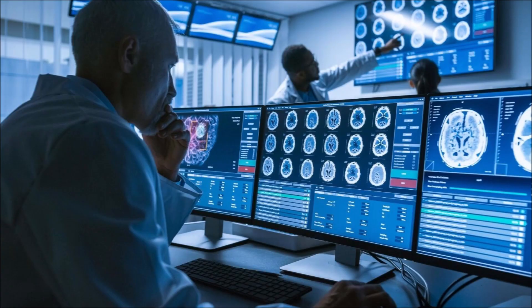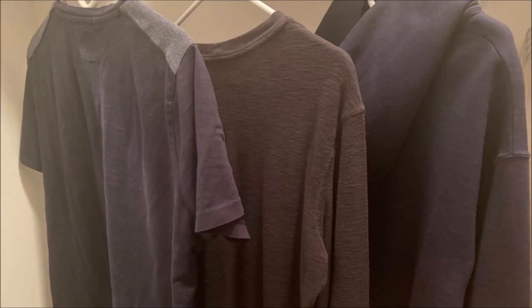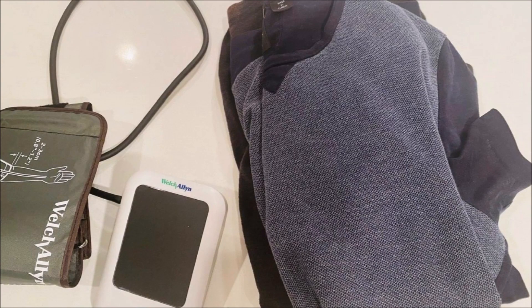So now that we know what the experts recommend and what the studies showed, I decided to perform my own personal blood pressure study to compare my results with theirs. I used three different shirt sleeves, rested two minutes between each measurement, and kept the shirts by my side so I didn't have to get up and walk around, maintaining consistency for each measurement.